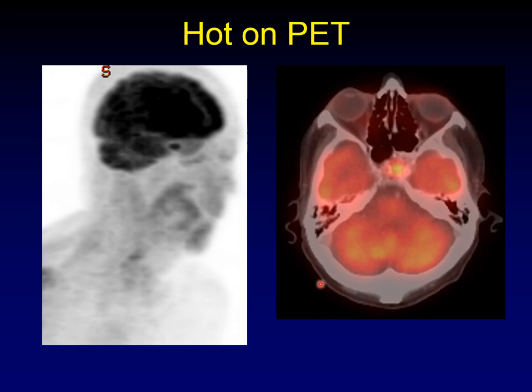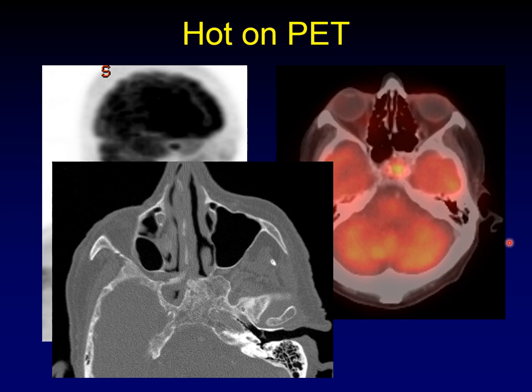Fibrous dysplasia can be very hot on PET. You can see a lesion on PET, and on the corresponding PET-CT it remains a hot lesion right in the middle of the skull base — but it turns out this is just fibrous dysplasia. Presumably the increased FDG avidity is from blood pool from this very vascular lesion.